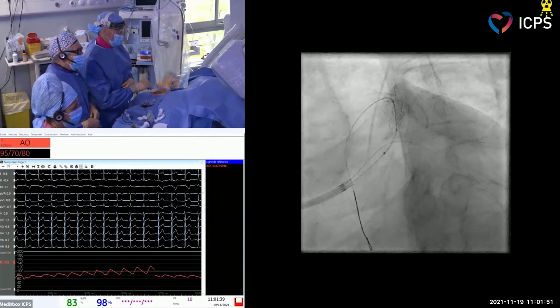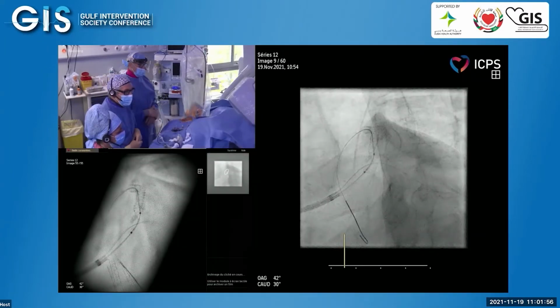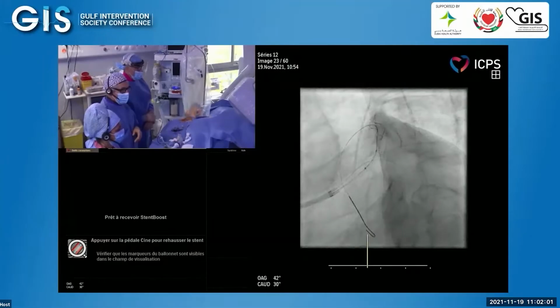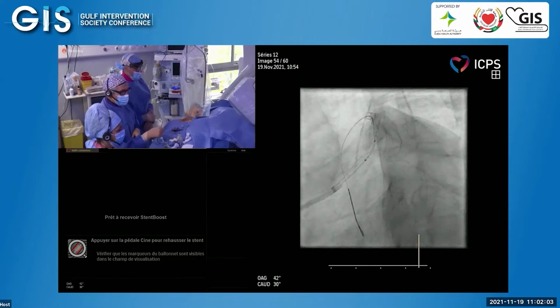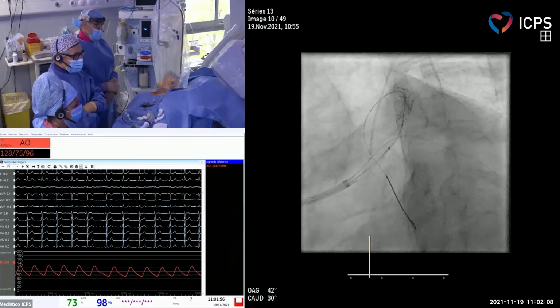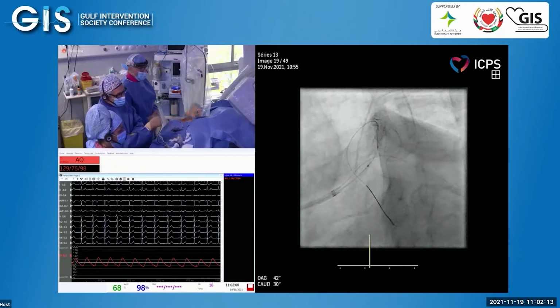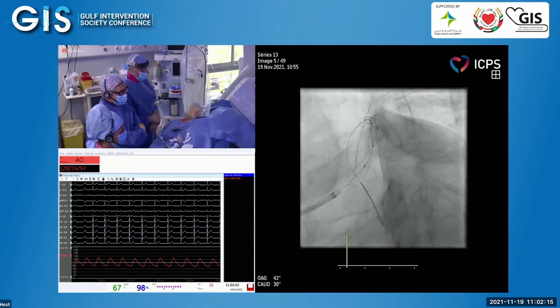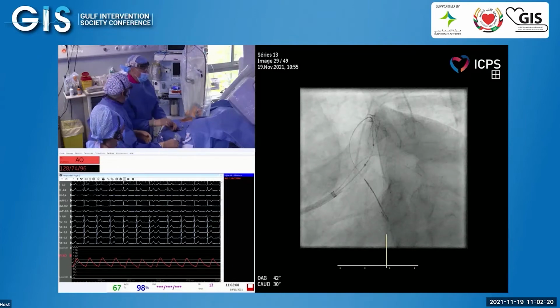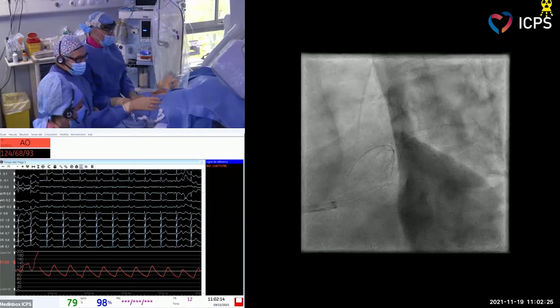Okay, so imaging is a must in this case. I mean, when you try to use Shockwave, is imaging a must-have? Oh, no, no. You can do a Shockwave without imaging. I think it's an open question. First the anatomy. If you're doing distal left main, imaging is required, just to see the sizes, to see the side branch orifice, and also as you found here, sometimes you see calcium that you didn't notice very well during angio. Can you see the eccentric calcification?